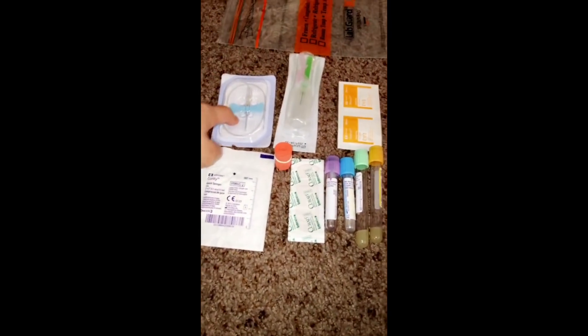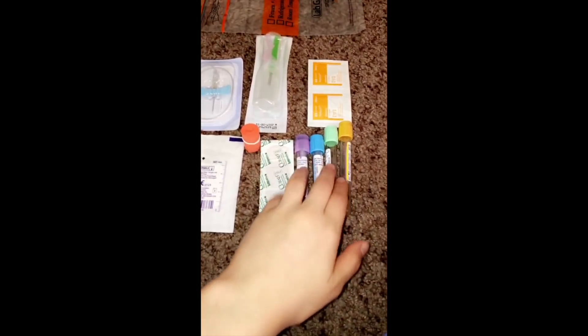So let's talk about names. This is a butterfly, this is a vacutainer, alcohol swabs, gauze, tourniquet, band-aids, and tubes.